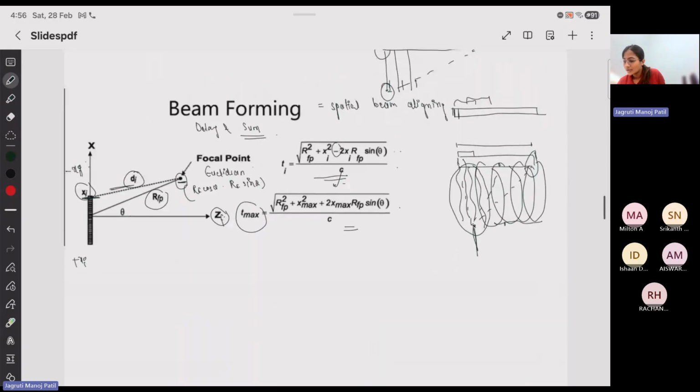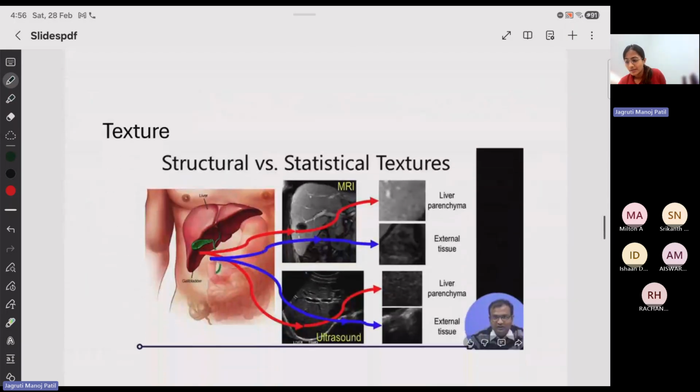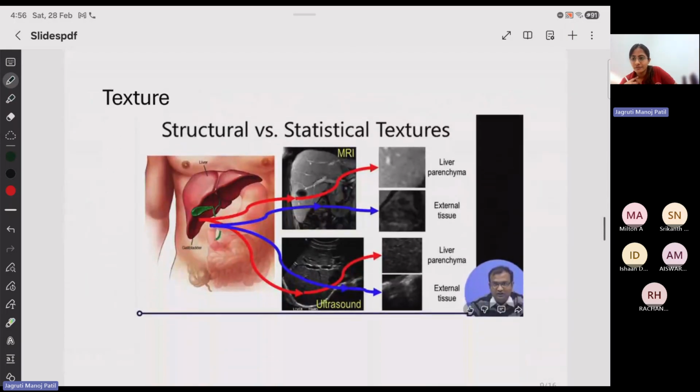So now you saw, on the first week, we saw different MRI images. Then later today, we saw different ultrasound images. If you image a tissue using two different modalities, the scattering changes, how that particular instrument performs and the principles and basics behind it are all different. So the images that you get are essentially different.